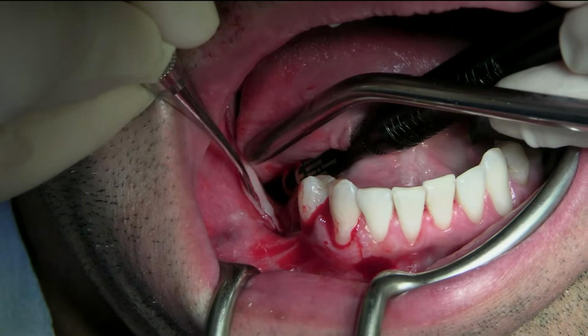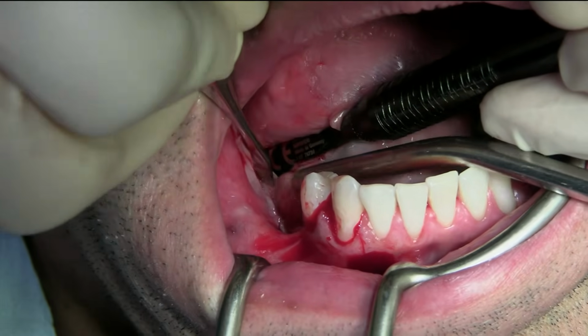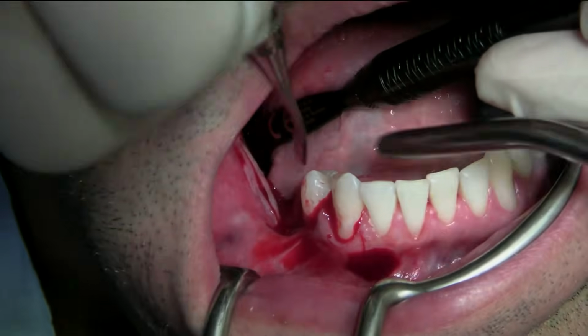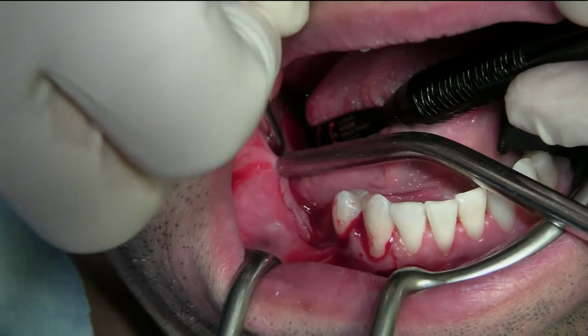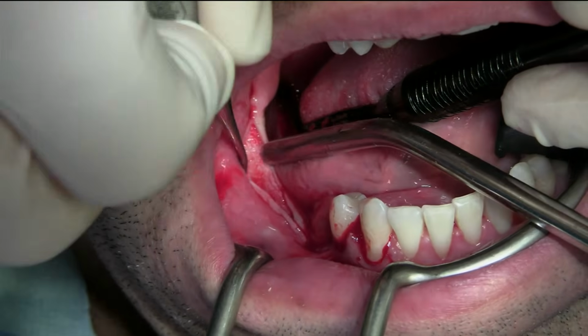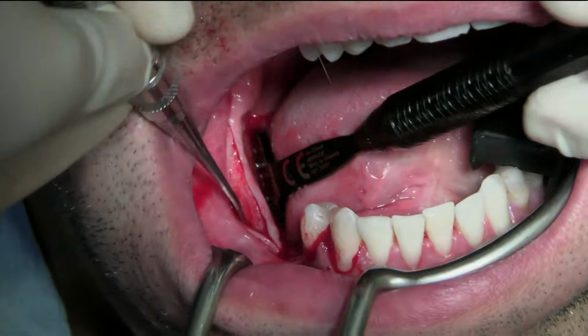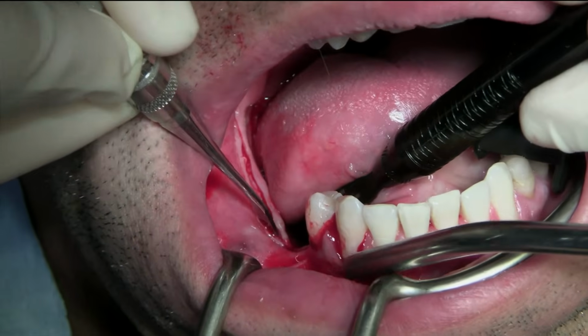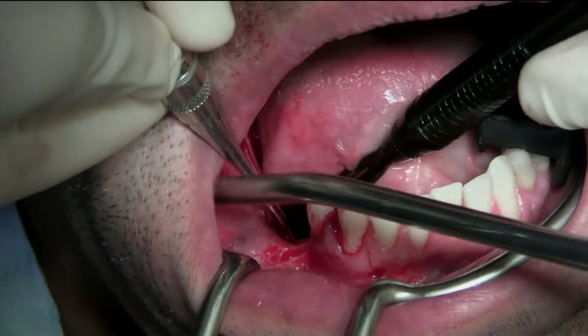Very careful here because it's difficult to get in this thin tissue. You feel a little bit there? Some pain? Are you in pain? A little bit? Okay, let's go anterior. Prepare some more anesthetic. It's ready.